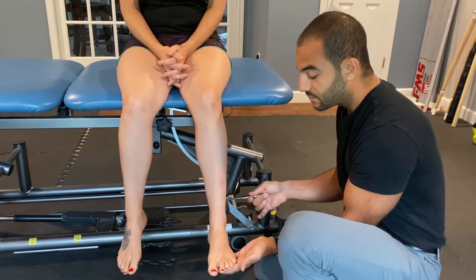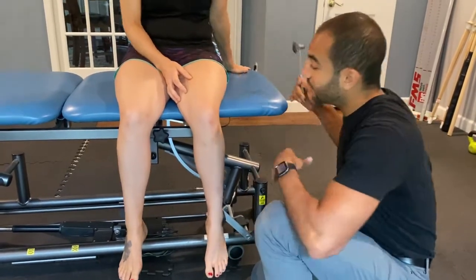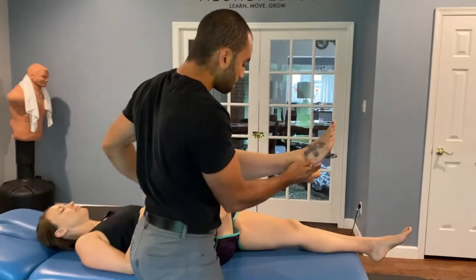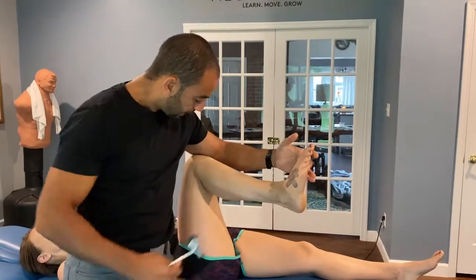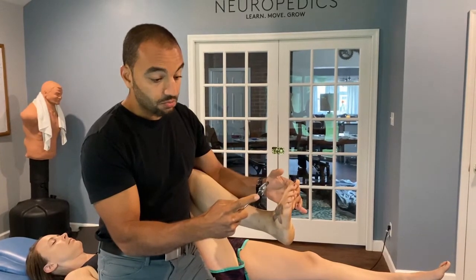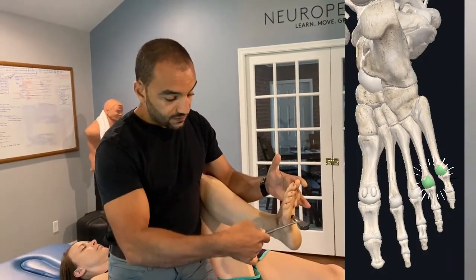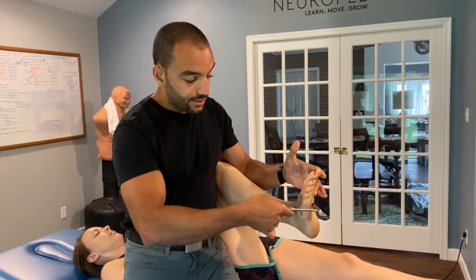Now a little trick, if you're not getting a good response at the Achilles, okay, we can lay her down. Go ahead and lay on your back. Okay. I'm going to come up like this. Okay. I'm going to create a little bit of a hugging of her knee in my armpit here. And then what I'm going to do is use the smaller surface area of the reflex hammer, and I'm going to hit right at the head of the 5th and 4th metatarsals to see if I can get a better response. And you can see how I can get a better response there.